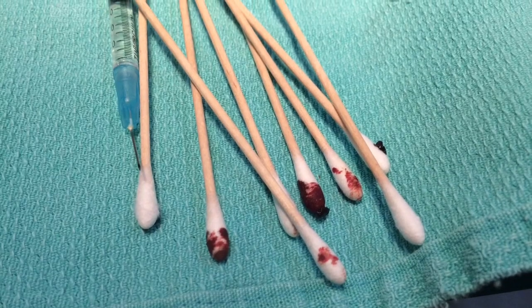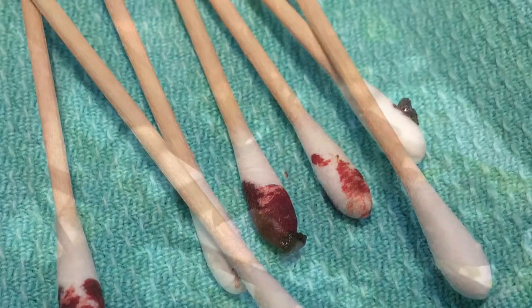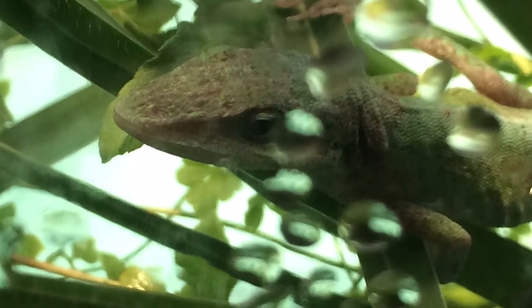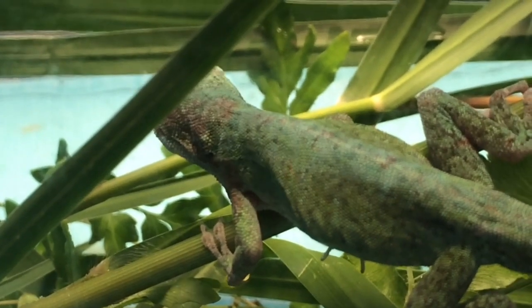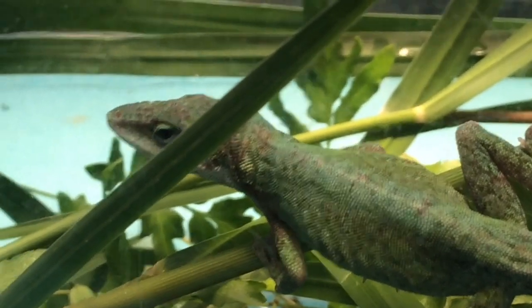Q-tips on a stick. All right, here we are a few minutes post-op and we're doing fine. The local block hasn't caused any problems. Obviously this girl is eating very well. All right — another successful procedure.